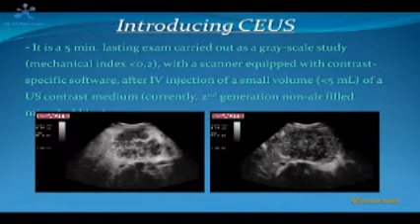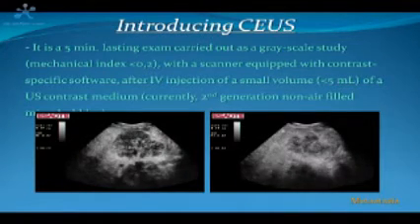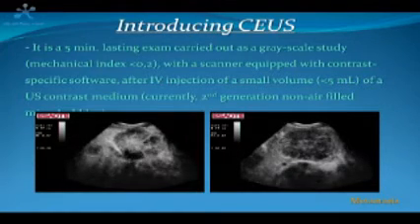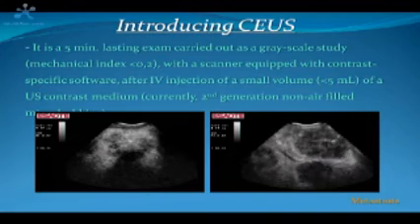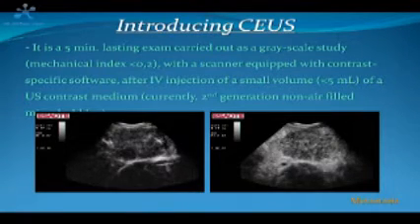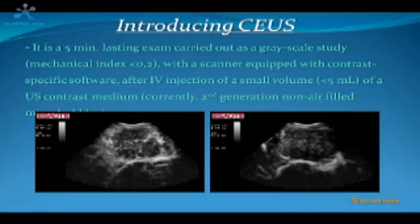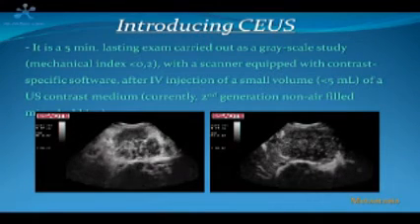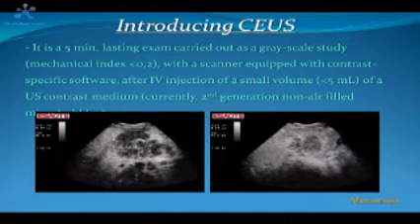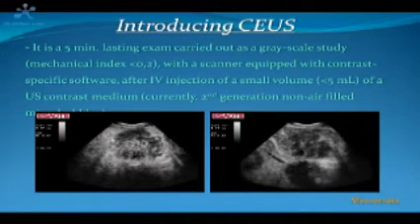So what is contrast-enhanced ultrasound? It's a less than 5 minutes exam which is carried out as an ultrasound grayscale study, but with a low mechanical index, with a dedicated scanner and probes, after injection of a really little volume of a contrast medium.